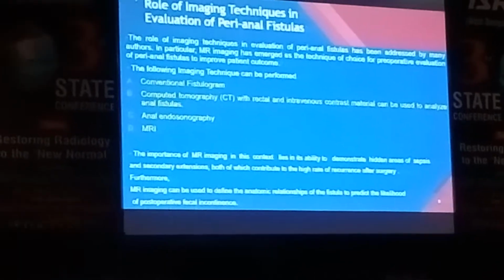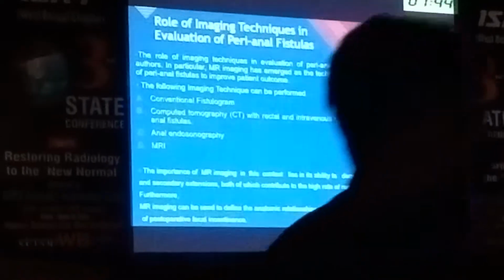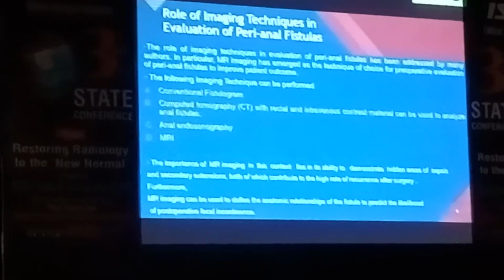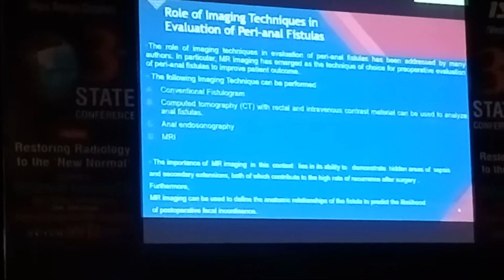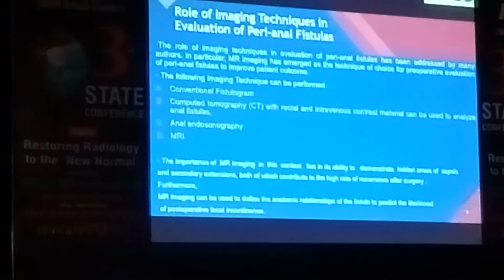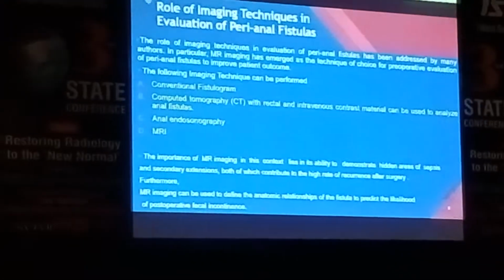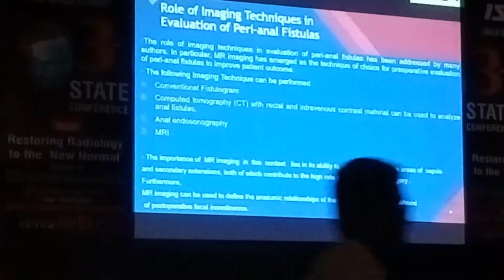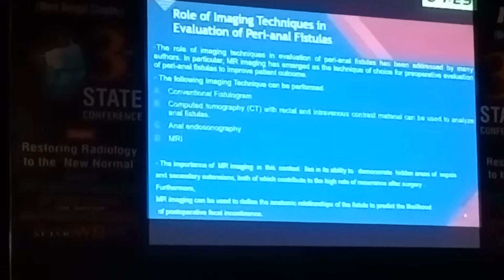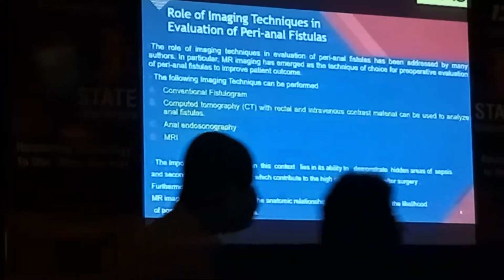Now, the role of imaging techniques in evaluation of perianal fistula. When we started our courses and in the early stage of our service, we were habituated with the conventional fistulogram. But now, in departments which have MRI facilities, doctors prescribe MRI fistulogram more than the conventional fistulogram, because the conventional one is an invasive process and MRI fistulogram is a non-invasive process.